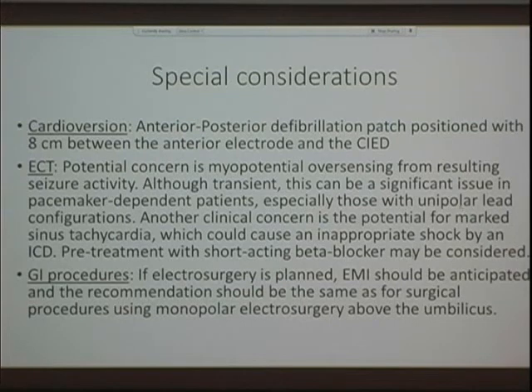The other thing, however, is that if you get sinus tachycardia post the seizure, then you need to know what the ICD detection rate is set at. And you might have to give them beta blockers in patients. Let's say if the ICD is set to act at 160 plus, there I would probably consider a preoperative beta blocker. But if the ICD is set for 188, then it's probably not necessary. But it's just something to be aware of, that anticipate sinus tachycardia with ECTs and make sure that the ICD is programmed well above that.